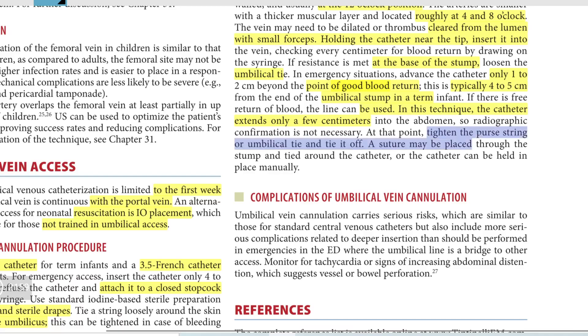At that point, tighten the purse string of the umbilical tie and tie it off. A suture may be placed through the stump and tied around the catheter, and the catheter can be held in place manually.